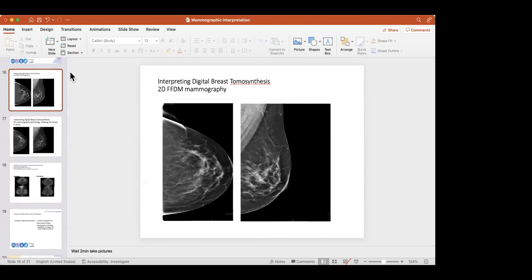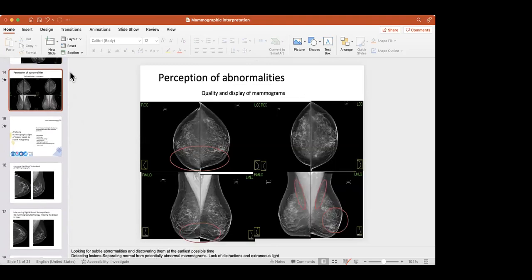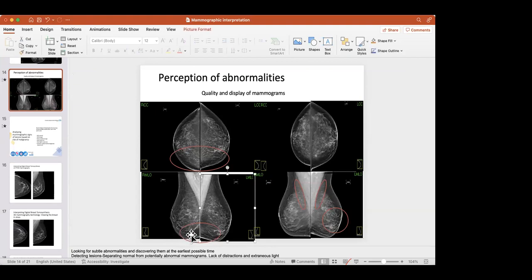Good positioning also means pulling the breast so that the inframammary angle is seen, the pectoral muscle comes down to the level of the nipple, and everything going on in the breast should be seen in the field of view.